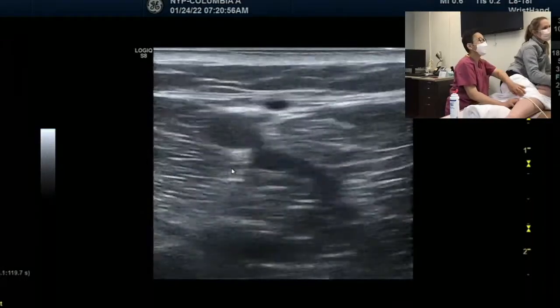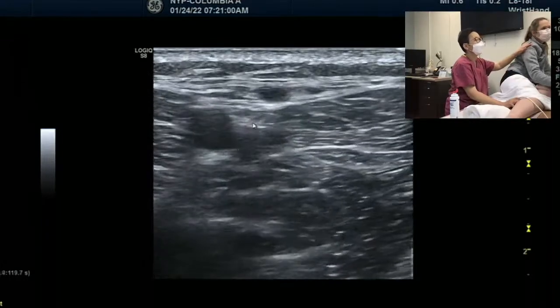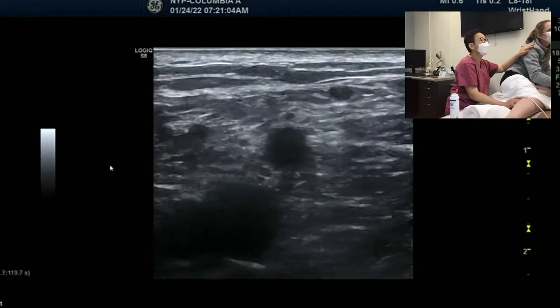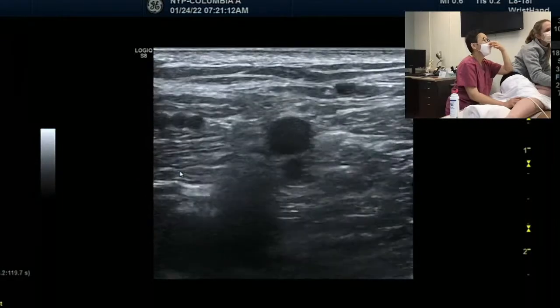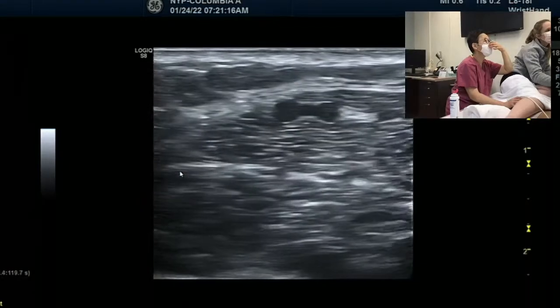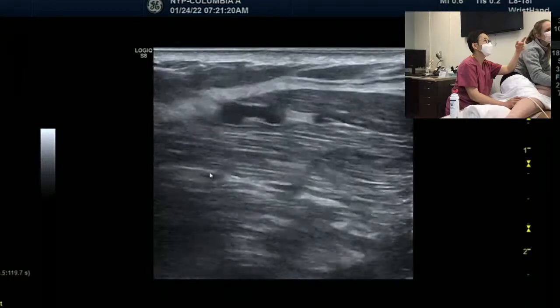Oh, yeah, it's hard. Here. The tibial nerve is over there. Oh my god, you are so good. I need the blood vessels. Okay, now you guys can see it. So here, another one is bothering me. That's going into the gastroc. The tibial nerve going into the gastroc. This one. Oh, see? Cool.